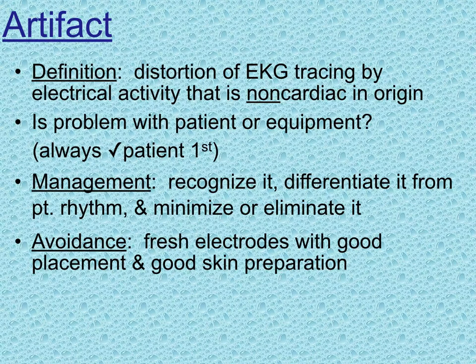Artifact is a very interesting phenomenon. This is considered to be a distortion in ECG tracing or EKG tracing by electrical activity that is non-cardiac in origin. It's basically some kind of interference of some sort. So if there's a problem, we want to know, is it with the patient or is it with the equipment? Always check your patient first, always assess your patient.